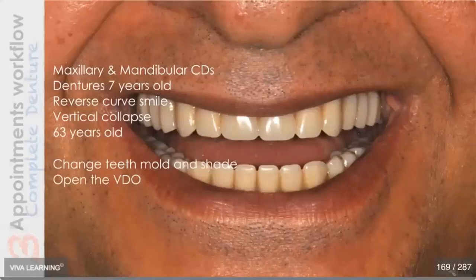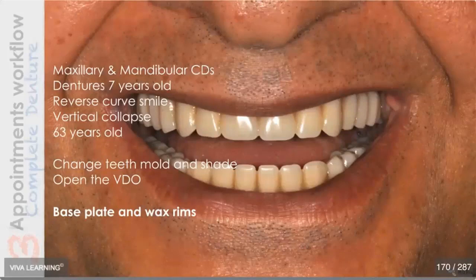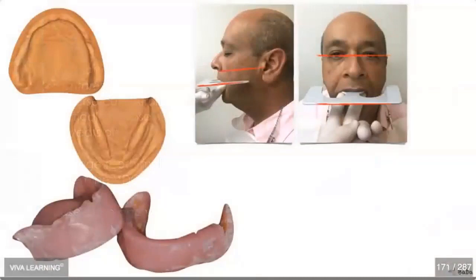For sure, I needed to open the vertical dimension. So I decided to go conventional, base plate and wax rims. And you can all do that too, but you don't have to invest in anything. You can just get to the base plate wax rims and then send it to the lab, and the lab takes it from there and digitizes your dentures. Let me show you how I do that.